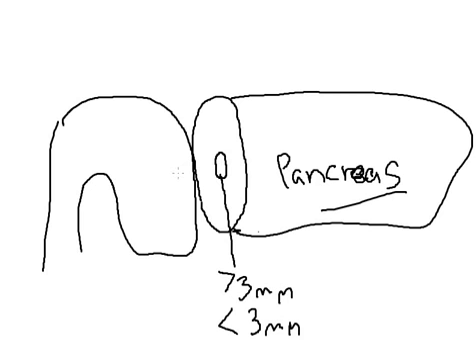I feel that performing this part of the operation in a technically proficient way and having a mental algorithm as to how to proceed is extremely important in getting good results. So the majority of my cases are duct to mucosa. A small pinhole is made in the jejunum here. The mucosa is opened and sometimes sutured to the serosa, sometimes not. I use 2.5 loop magnification. I use 6.0 monofilament absorbable sutures such as PDS, and perform this anastomosis in a duct to mucosa fashion.